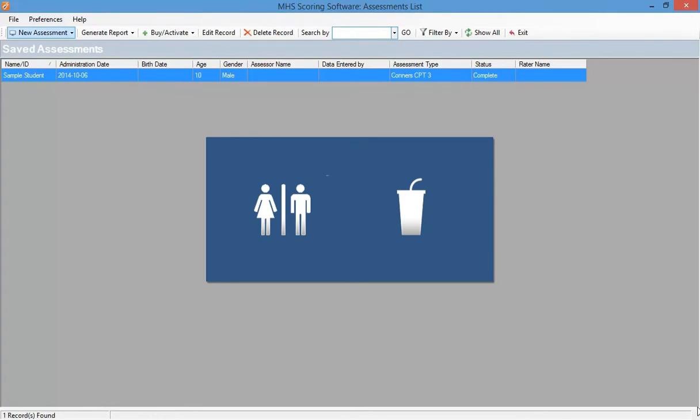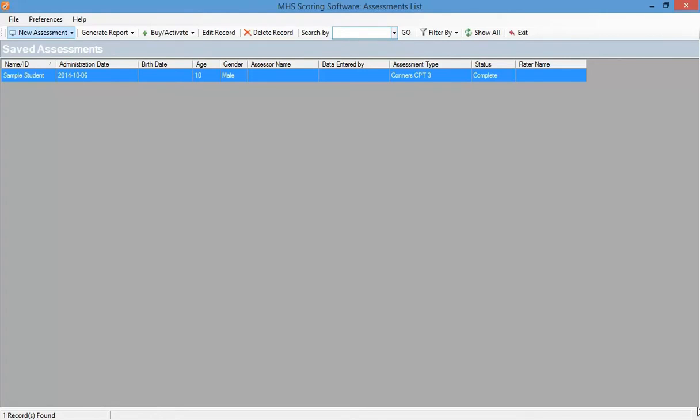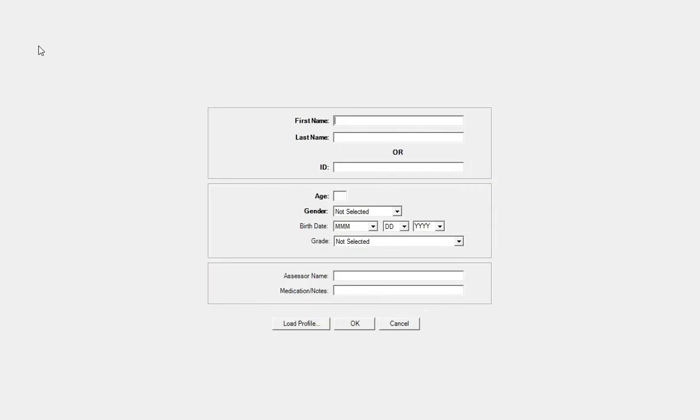Once you are ready to begin the administration, you will select the Connors CATA from the new assessment menu in the MHS scoring software. Then, just like the Connors CPT-3, you enter the respondent's name and demographic information and click OK to enter the practice test.